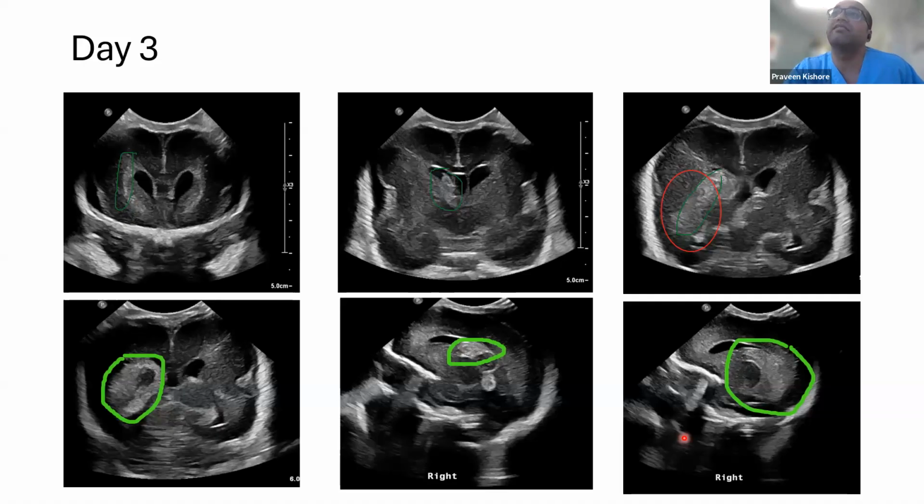So no, you can see unilateral bleeds, and you will see as we see the progression that it's not exactly unilateral. The right side is more affected, but the left side seems to have some changes. And when we see the next few images, we'll start to see that there was some more blood on the left side as well. We'll go to the next slide.